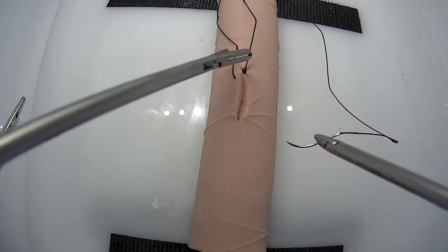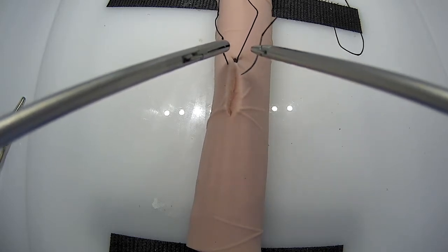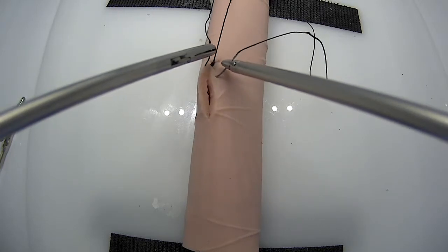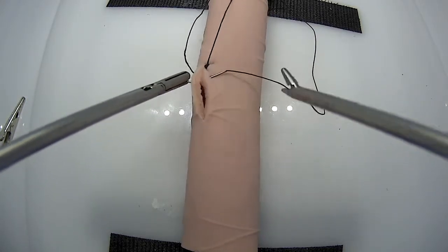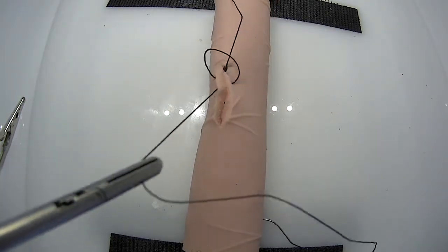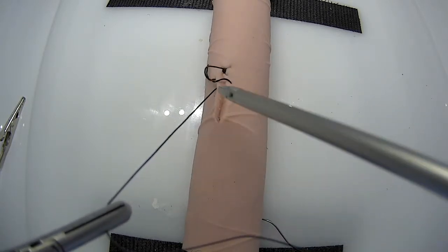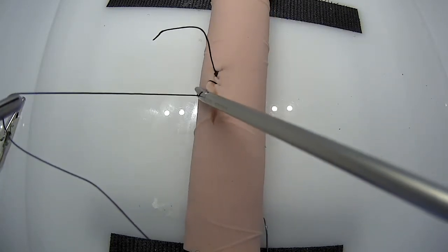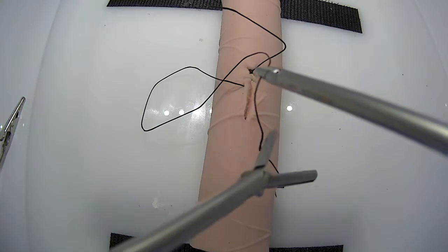You can grab the suture and follow yourself, as long as the bowel's aligned, making sure you take full thickness bites here. And again, these do not have to be very large bites. You should space them out every 2 to 3 millimeters along the incision. Make sure your tail doesn't get caught. And you're going to cinch after each of these closure bites is complete.